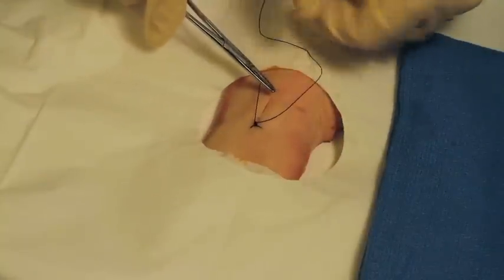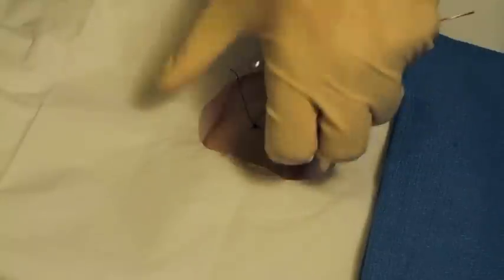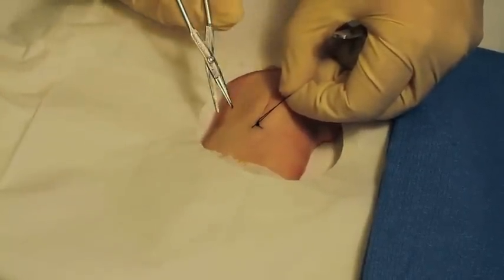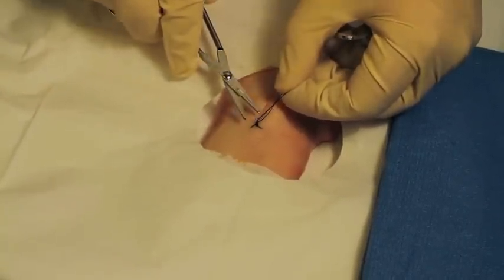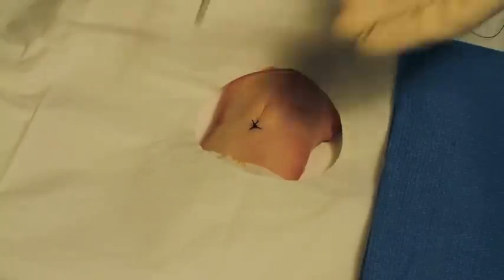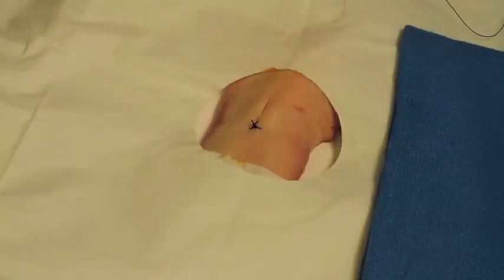Now take your suture scissors — the third instrument that comes with your standard suture kit — and cut it relatively short because you're saving suture. You can see that it put the skin actually quite close together — it's a nice little suture there.